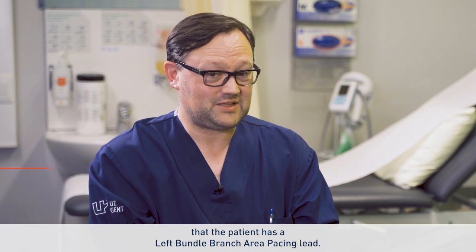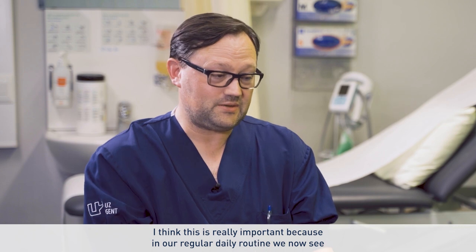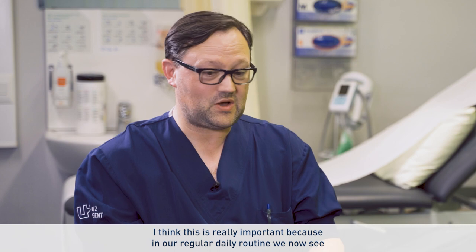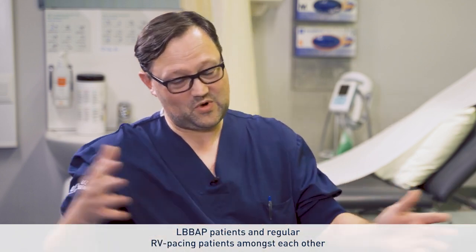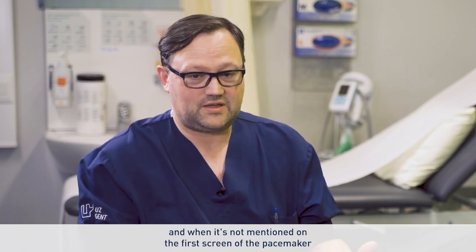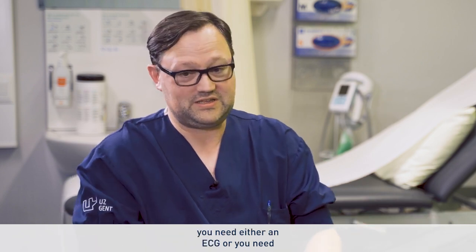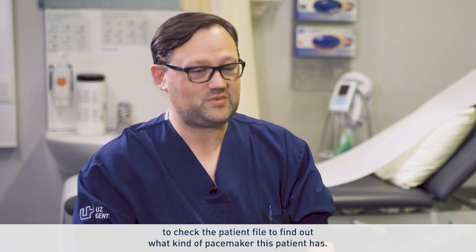We can now program that it is an LBBAP pacemaker, that the patient has a left bundle branch area pacing lead. I think this is really important because in our regular daily routine we now see LBBAP patients and regular RV pacing patients amongst each other, and when it's not mentioned on the first screen of the pacemaker, you need either an ECG or you need to check the patient file to find out what kind of pacemaker this patient has.